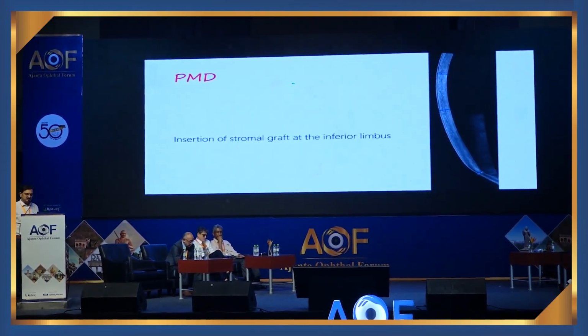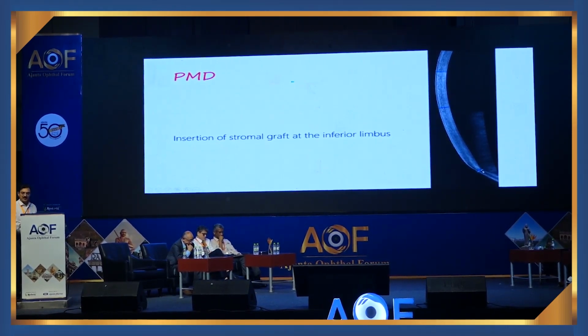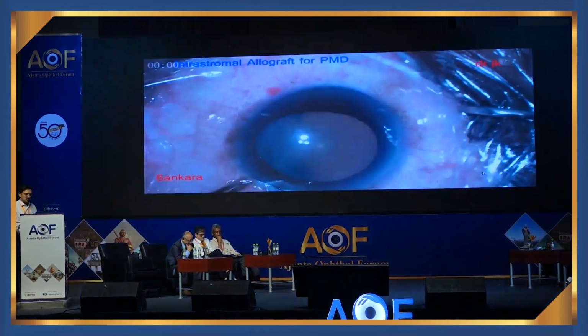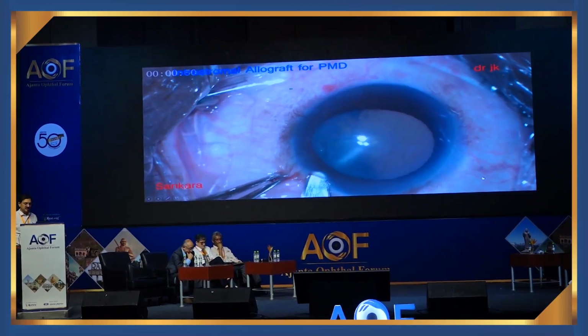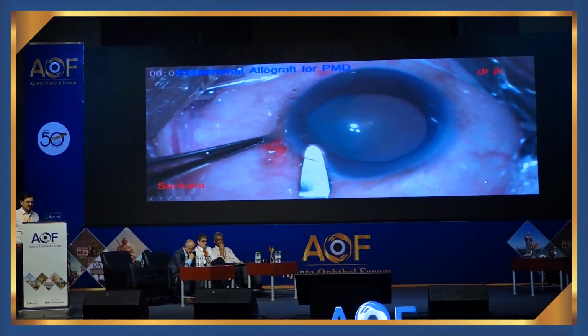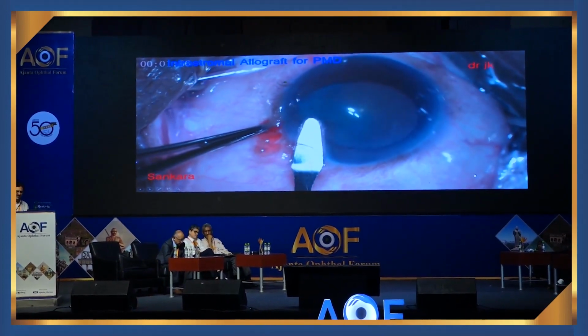This is a difficult proposition, because the cone is very thin, you see here, 200 microns, 250 microns. At that stage usually the patient comes. So in this case, the surgery is very simple. Under topical anesthesia, make a cut at the limbus, and with a crescent knife we can easily make a tunnel. It comes very easily. The tissue is very soft.